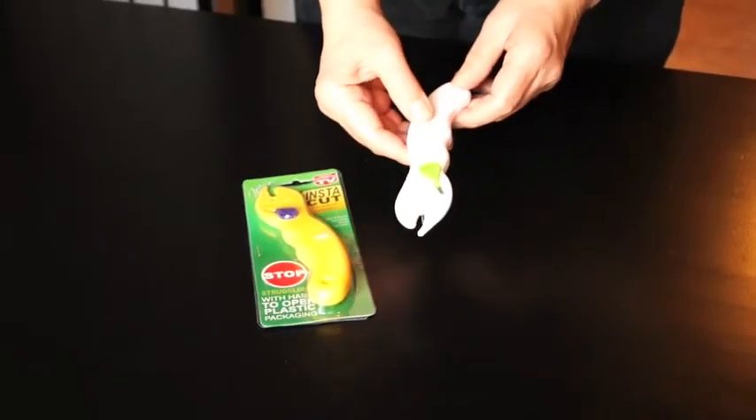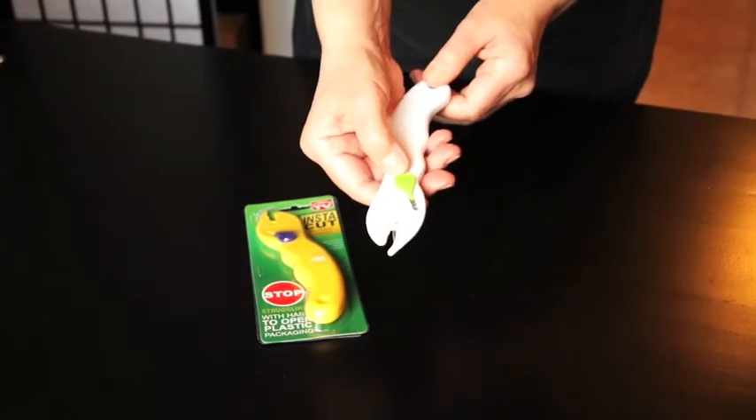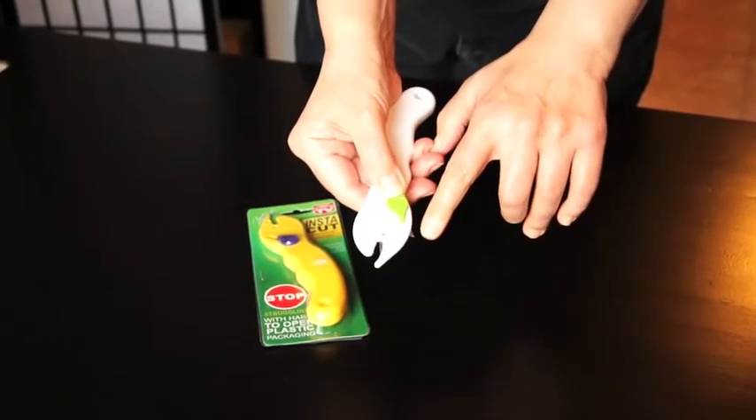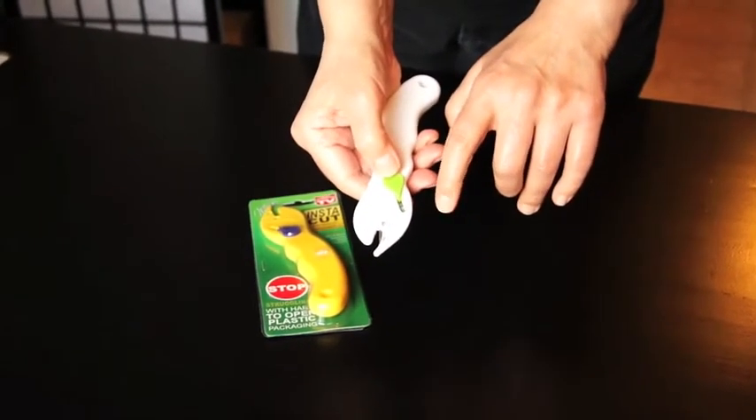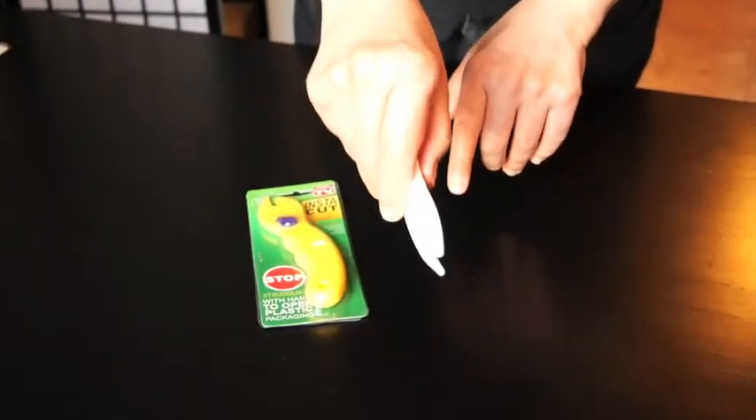These gadgets I got from a dollar store. This one here is for opening those horrible plastic packets. There's a little knife blade that comes out here, and then once you've gone around that, there's a blade in here and you can just run around the edge like this.